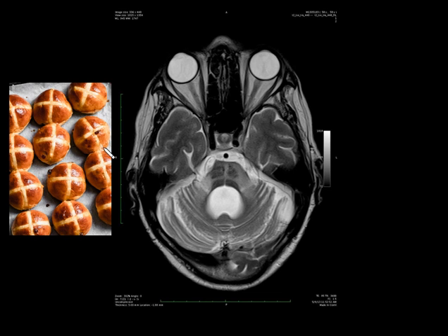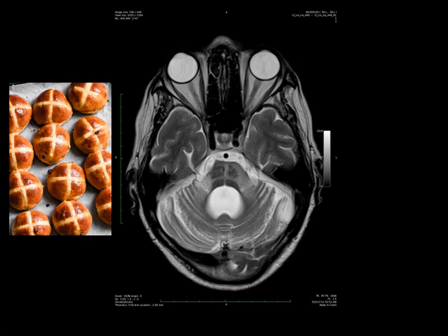Coming to the next case, you can see the classical hot cross bun appearance in MSA type C. This sign is due to selective loss of myelinated transverse pontocerebellar fibers and neurons in the pontine raphe with preservation of the pontine tegmentum and corticospinal tracts.